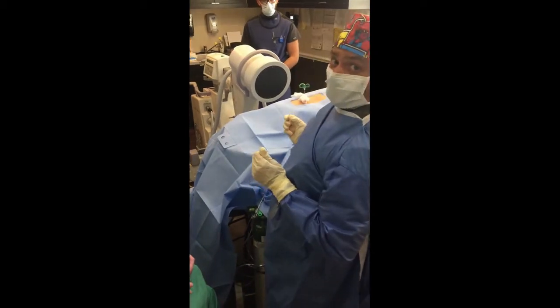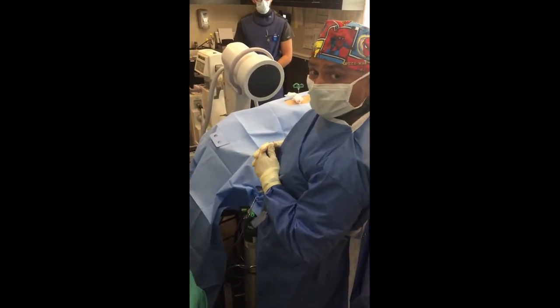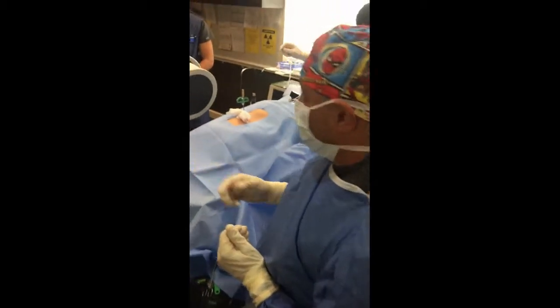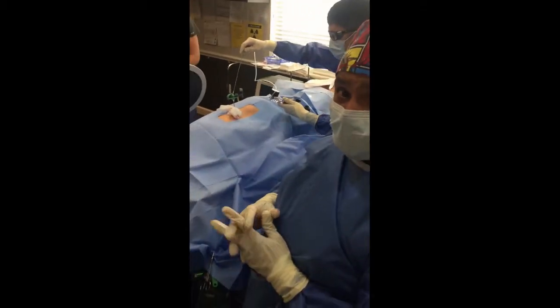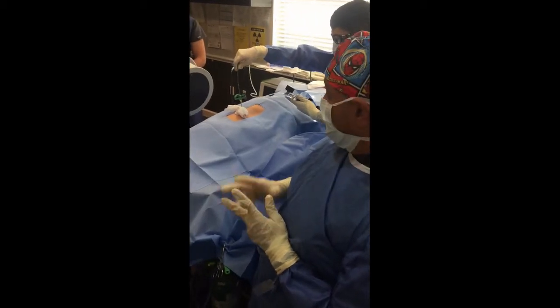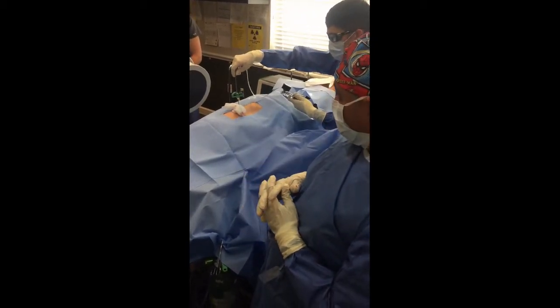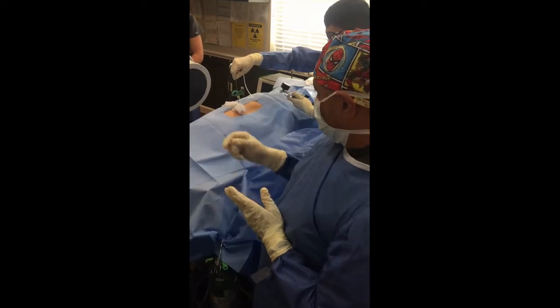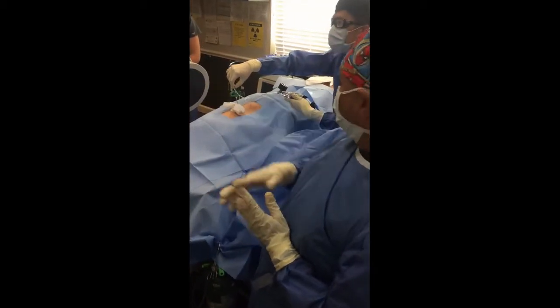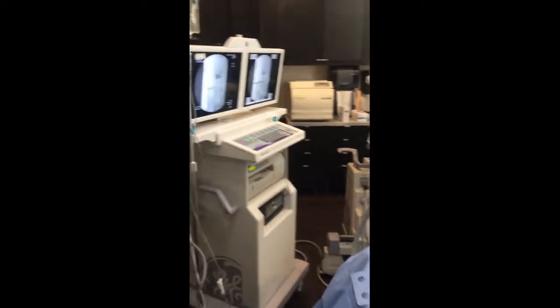So now we're at the part, basically, where we're going to go ahead and insert the balloon in for the kyphoplasty. So go ahead, Dr. Chen, let's go ahead and walk that balloon down. So the balloon has been primed with contrast. Contrast is basically what allows you to see where you're going. You're going to see him as he advances that balloon down. Keep going. You got to get that other white line in. Okay, so you can hold it from the bottom and get there. And you'll see it. You see how the balloon is nicely in the center of the vertebral body.